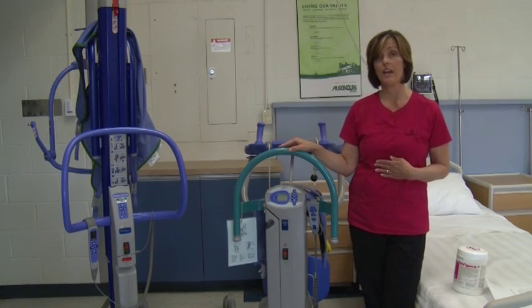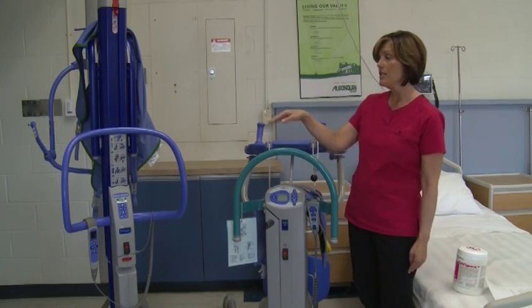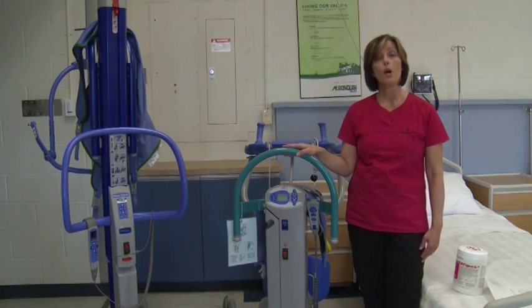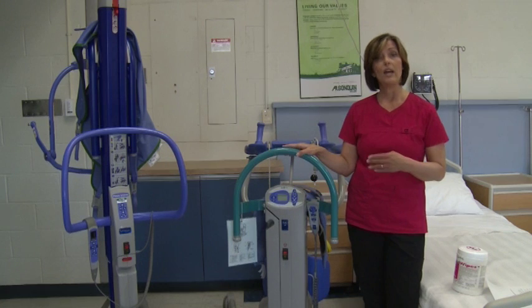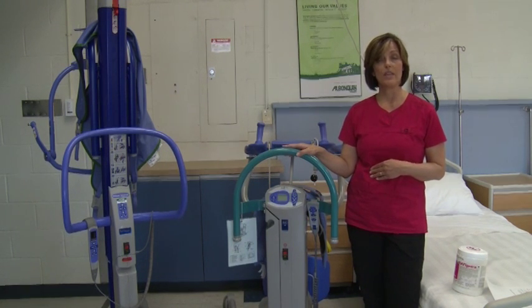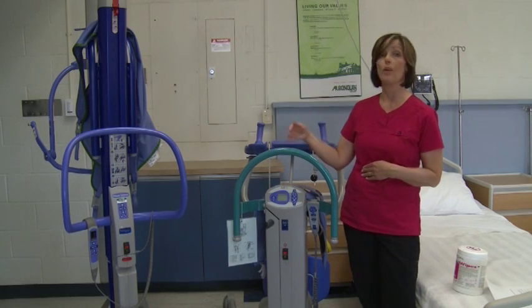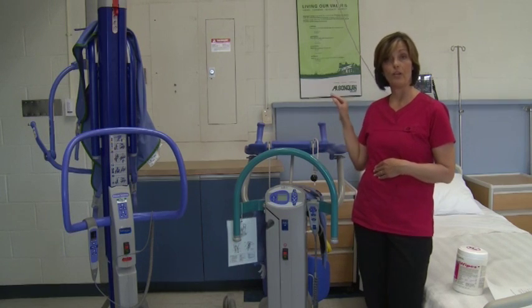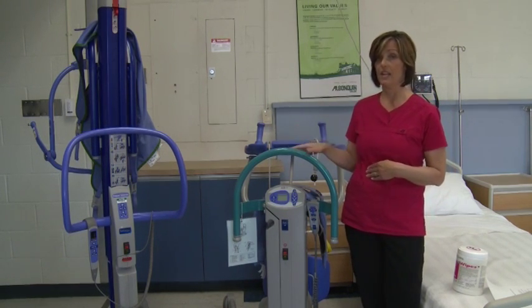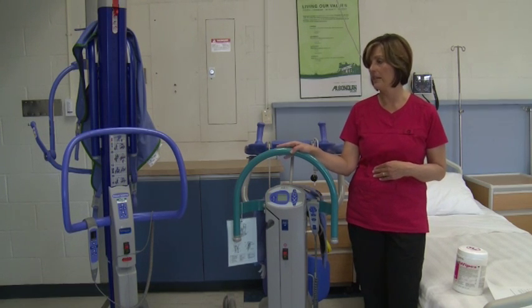In our labs at Algonquin, depending upon your program, you will have the opportunity to practice using the lifts. However, what we also encourage you to do is to take advantage of being the patient when the lifts are being practiced with, because it will give you a true perspective of what your client is actually going through when they are placed in a lift sling or when they're moving from sitting to standing as they would be with the Encore lift. We encourage you to have the opportunity to practice that.